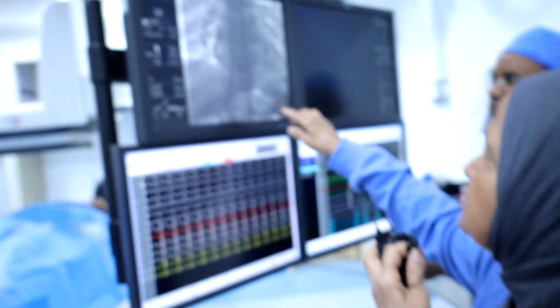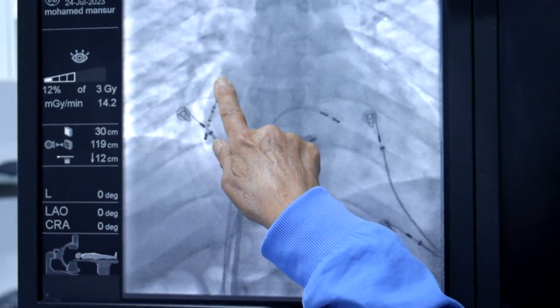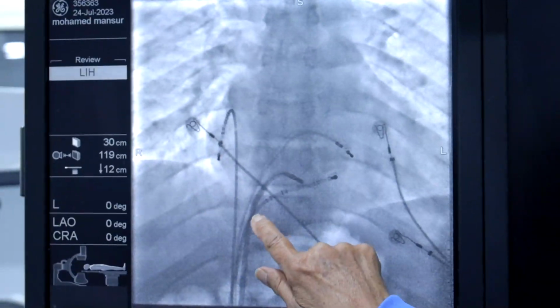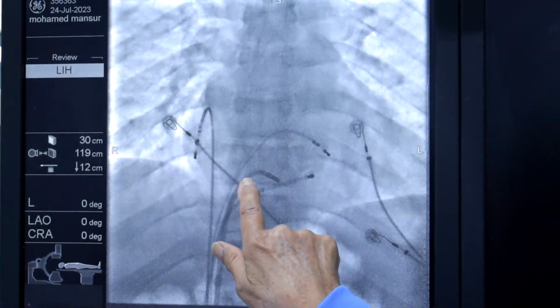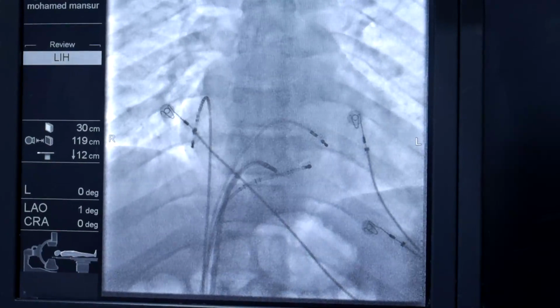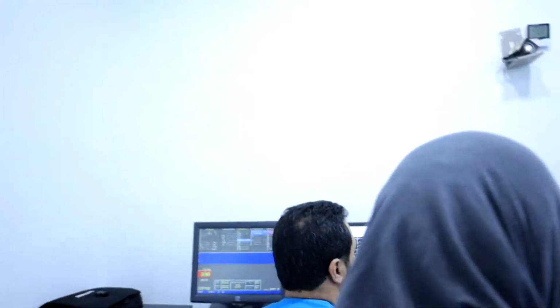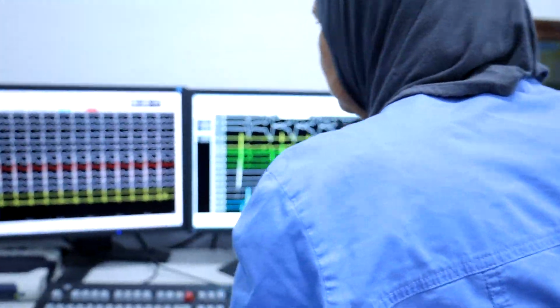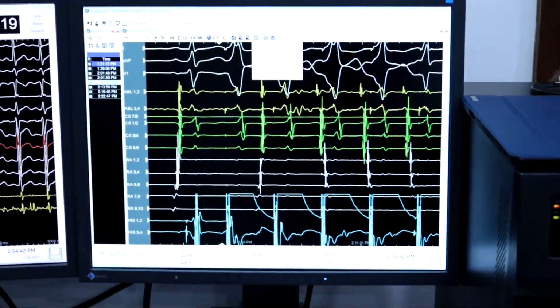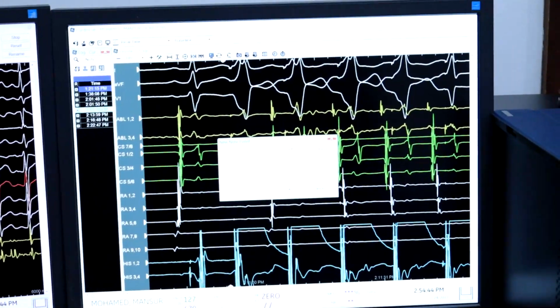The catheter placement here, this is the right atrium. We use a decapolar catheter and the CS decapolar catheter, and this is the His catheter, and this is the ablation catheter where we ablated it. Here I don't like the halo now because it is very bulky and it does not say what I wanted to say, so I use the decapolar catheter instead.